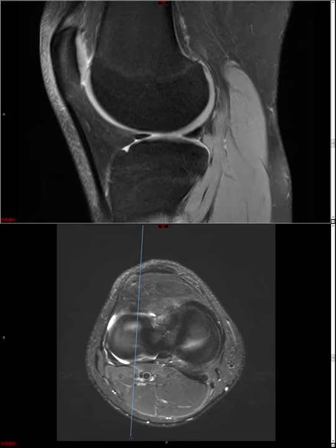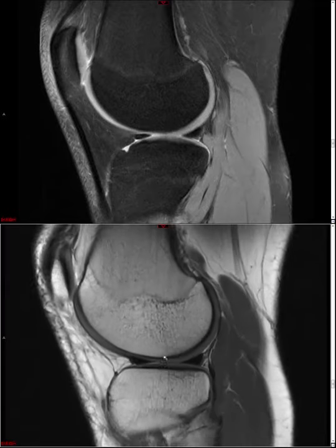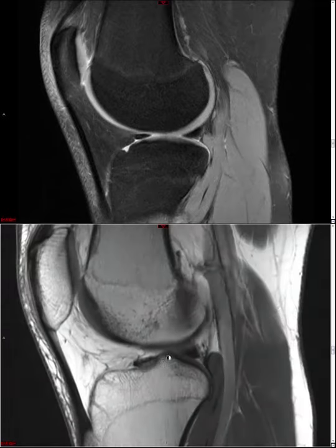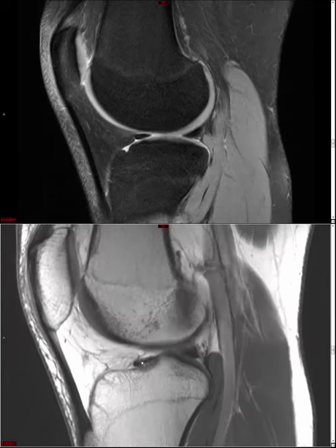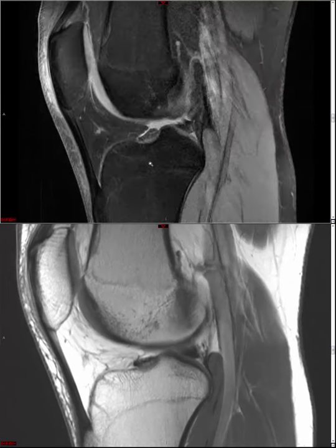Also, while we're on the subject of the anterior horn lateral meniscus, and you're going to find this over and over again in MSK radiology, this is one of these structures that may normally have some increased signal, usually some striated signal, and you're just going to have to look at a lot of these before you can recognize this as being a normal appearance. For now, you just have to take my word for it that this is a normal anterior horn, anterior root attachment. So the root attachments are very important.